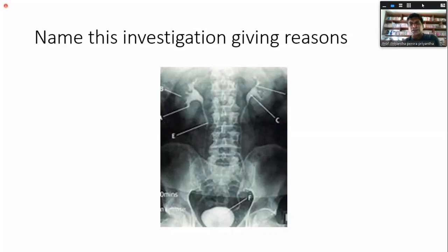One thing is you have to catheterize the child, right? For MCUG, you have to catheterize the child, so you can induce trauma and cause stricture. So that's one thing, it is an invasive procedure involving catheterization of the child. It's not easy in a small child, especially an uncircumcised child. And the other is that you are exposing the gonads, not the genitalia, the gonads, right? Because ovaries and testes are directly exposed to the radiation.